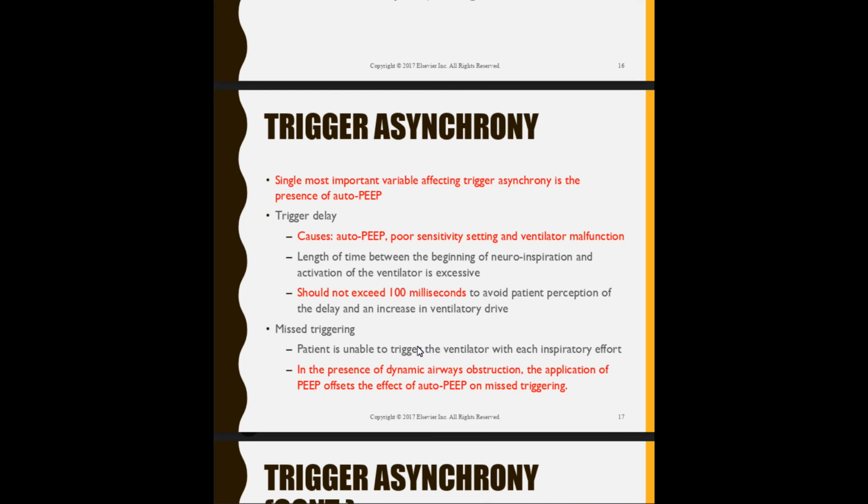So now you have this prolonged gap of no ventilation or oxygenation, and therefore you will have a low VQ, correct?